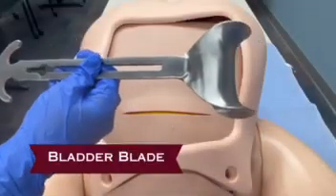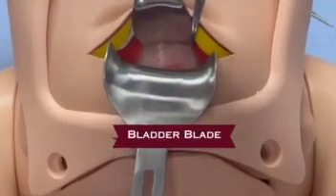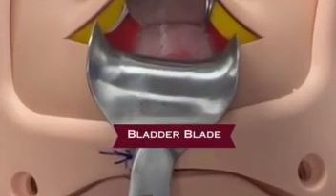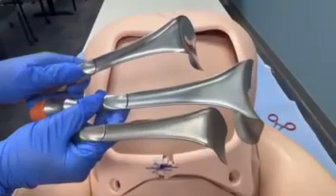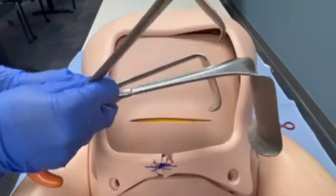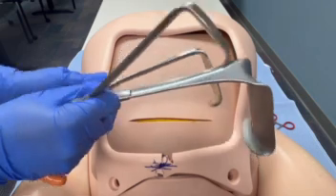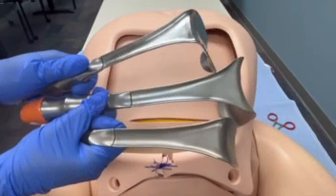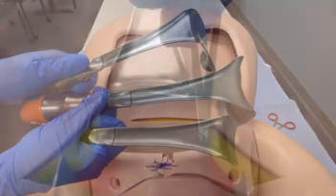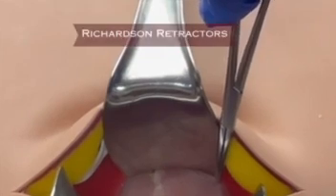The bladder blade is a curved, circular retractor used to ensure the bladder is protected against potential injury when operating on the nearby uterus. The Richardson retractor, or Rich, is another type of handheld retractor used to hold back tissue to visualize the surgical field. It has a right angle with a slight lip at the base and comes in various lengths depending on how deep of a retraction is needed. It is often used to hold back abdominal adipose, as shown here.